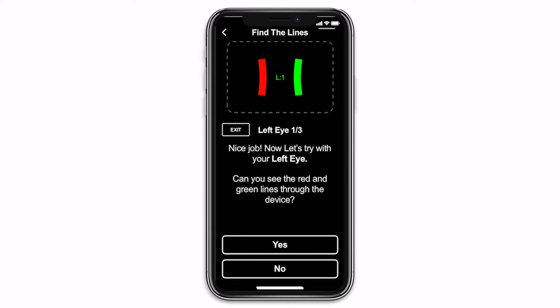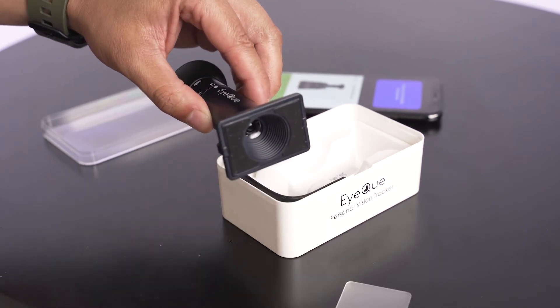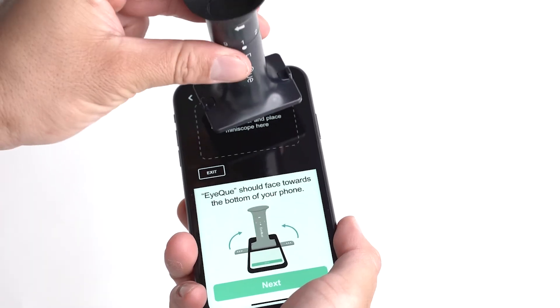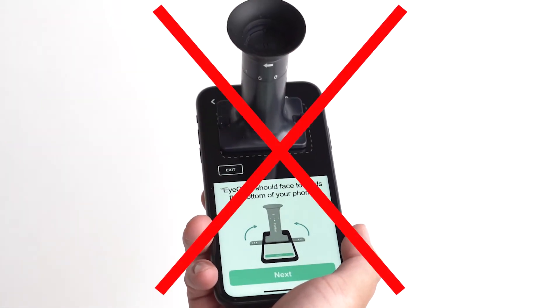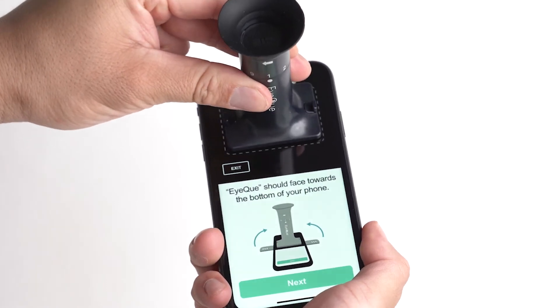To start testing, remove the protective cover at the base of your device. Then attach the device to your smartphone within the dotted lines. The micro-suction tape on the base of the device will prevent it from sliding. The EyeQue logo should be facing downwards and set to position 1.